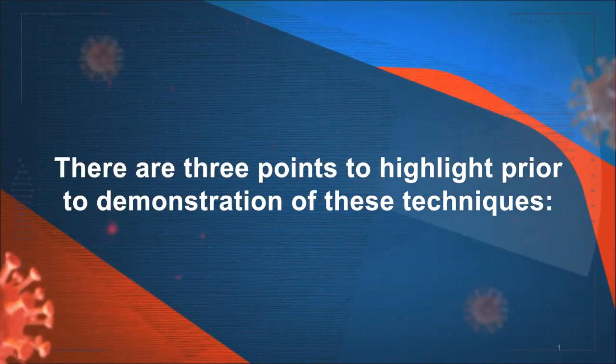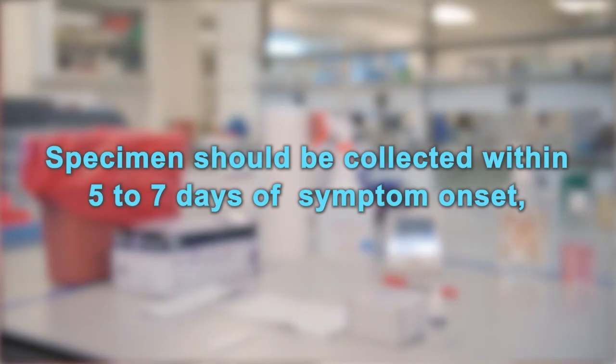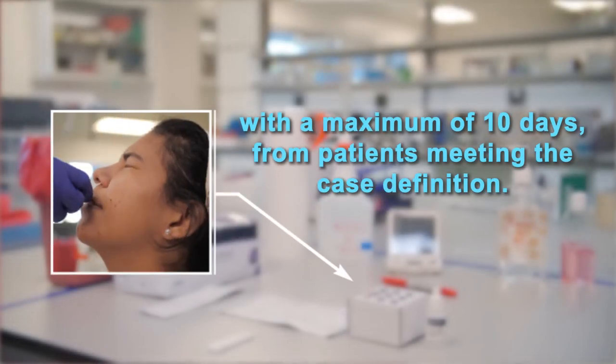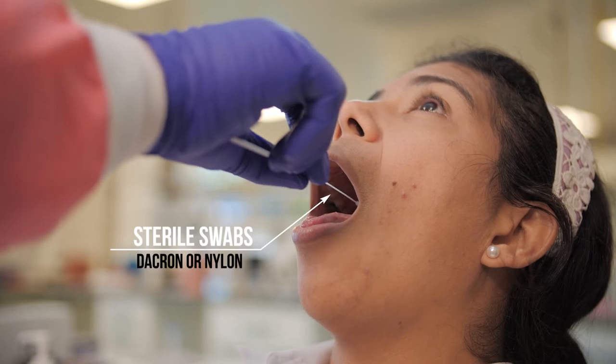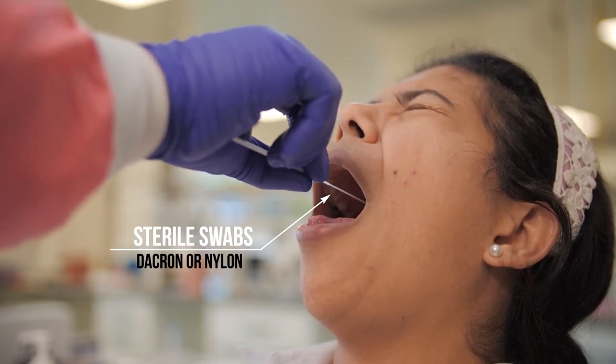There are three points to highlight prior to demonstration of these techniques. Specimens should be collected within five to seven days of symptom onset, with a maximum of ten days from patients meeting the case definition. Only sterile Dacron or rayon swabs with plastic shafts or flocked swabs should be used. Do not use calcium alginate swabs or swabs with wooden sticks.